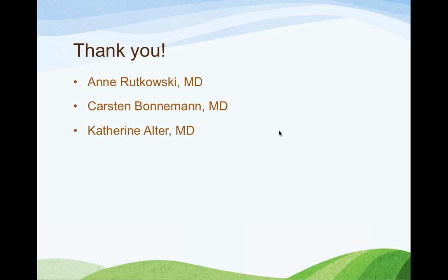I've spent a lot of time trying to get patients that are unaffected by muscle disease to find values for a quote-unquote normal range. And then I have been getting data on our collagen 6 patients and Lama 2 patients based on the ultrasound study that I did for the summer study that happened last year. I've also been able to do this in Duchenne patients. So far, preliminarily, it looks like the tibialis anterior muscle is the most consistently distinguishable muscle in terms of muscle stiffness between all of these disorders.